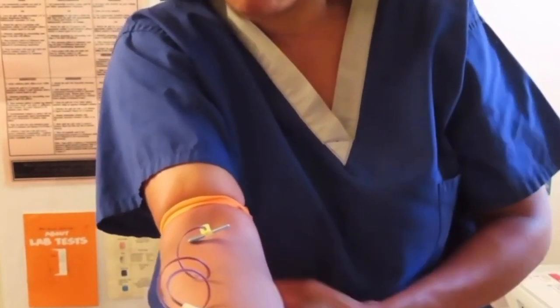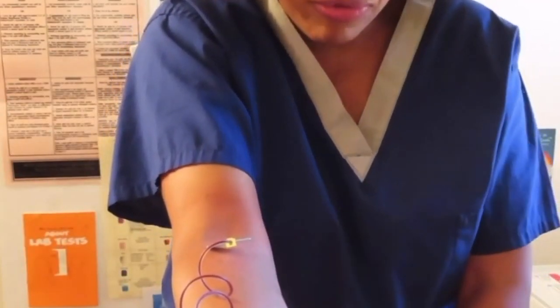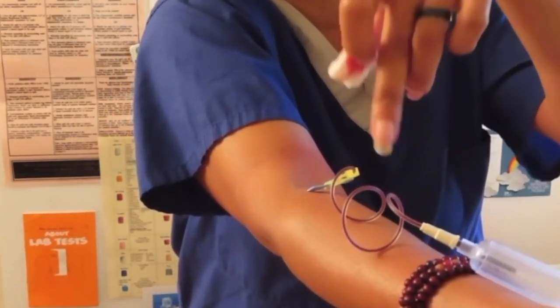I didn't pop my tourniquet, but of course I should have done that already by now. But as you can see, we were successful. We got our blood, but that is your middleman. And if you're having trouble, be careful with your butterflies.